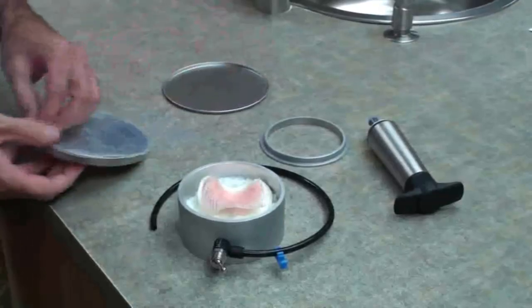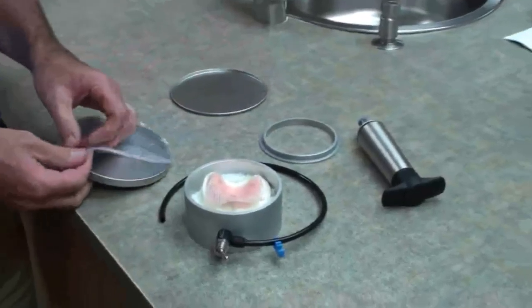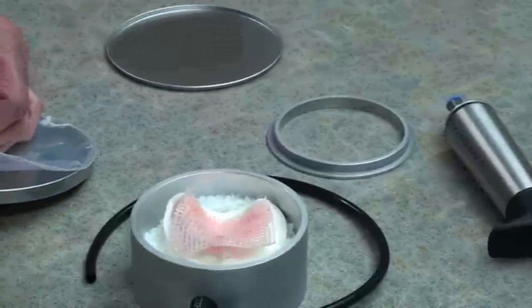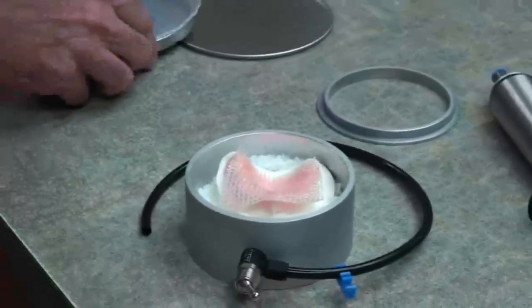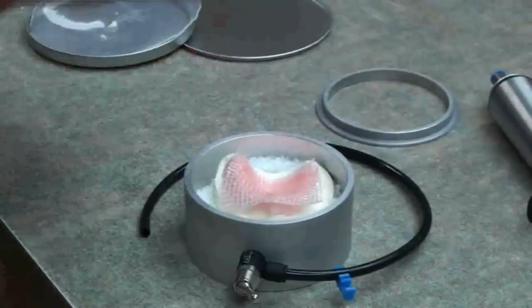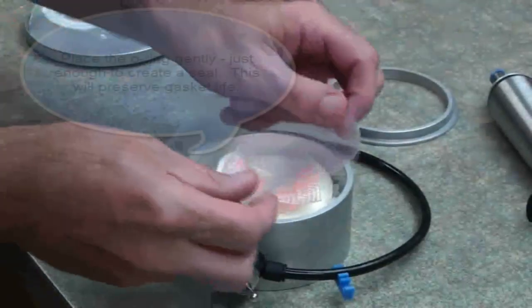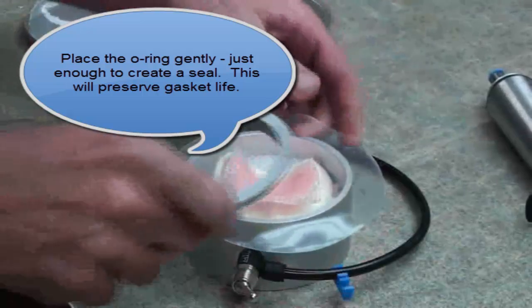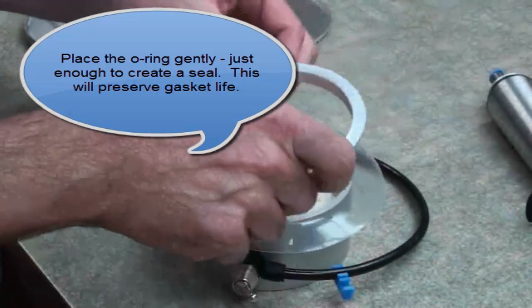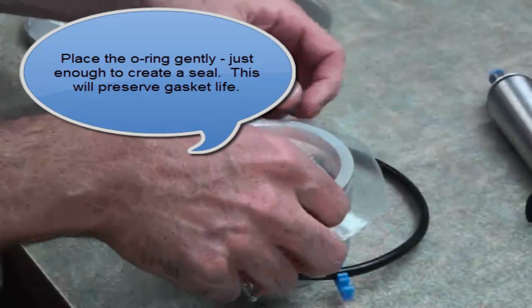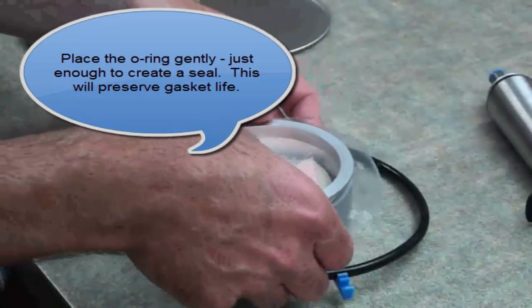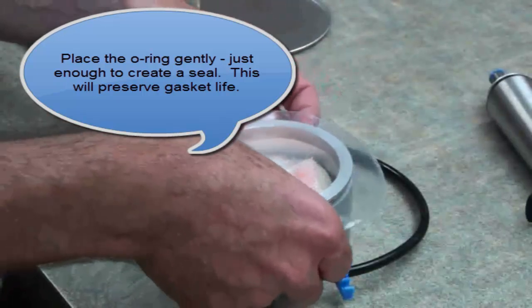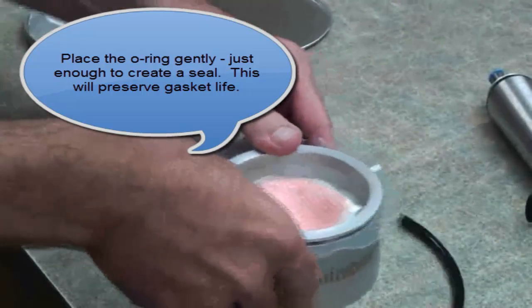Each splint vac unit comes with three reusable silicone gaskets. Remove one from the package and place it on the top of the chamber. Being careful not to pinch the gasket, apply the aluminum o-ring into place to seal the splint vac. The o-ring only needs to be placed firmly enough to create a complete seal. If it's seated too firmly, it may damage the gasket and make the o-ring more difficult to remove.